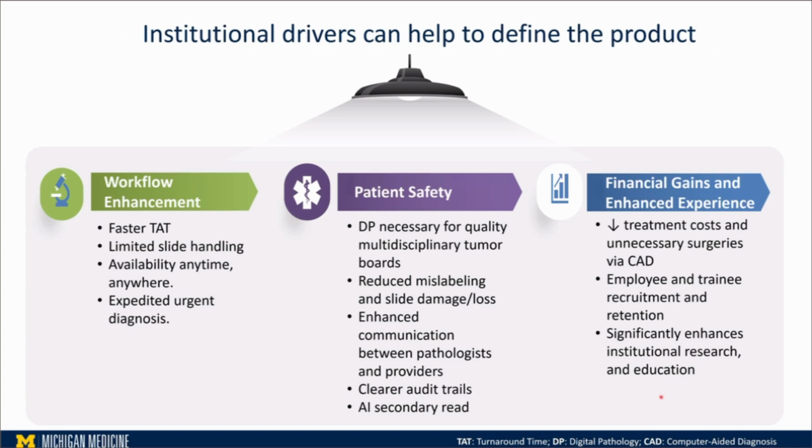The other thing we took into account is institutional drivers that really help us define the product. From our point of view, we divided them into workflow enhancements, patient safety, and financial gains and enhanced experience. For workflow enhancement, the goals are faster turnaround time, limited slide handling, and expedited urgent diagnoses.